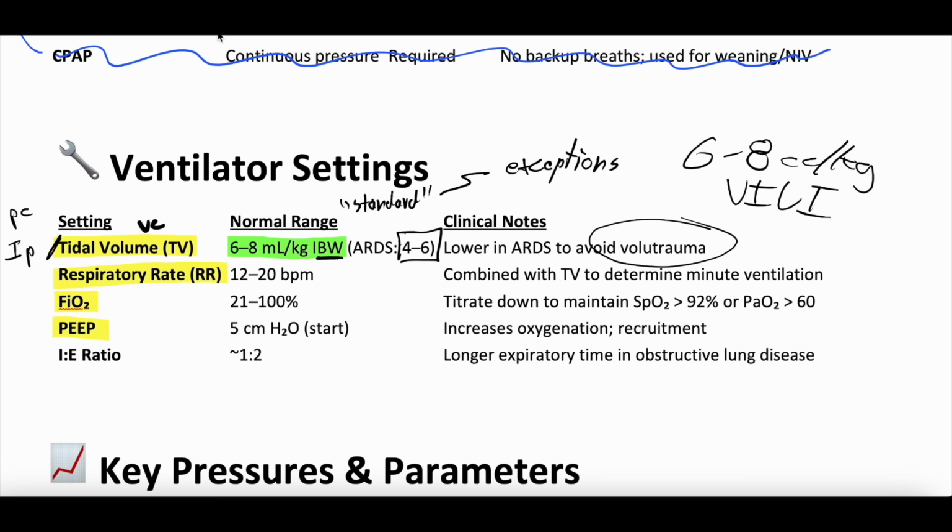All right, respiratory rate. We often start with normal respiratory rates, something like 12 to 20. You hear 16 a lot, which is reasonable. Remember that the tidal volume times the respiratory rate determines your minute ventilation. So if you have someone who's in profound metabolic acidosis, their pH is very low, and you know that they're breathing like mad to try to breathe off extra carbon dioxide, right? Try to have a respiratory compensation for their metabolic acidosis. I guess we're just full of plugs today, but we've got a whole series on acid-base status too. If you're interested, check it out.